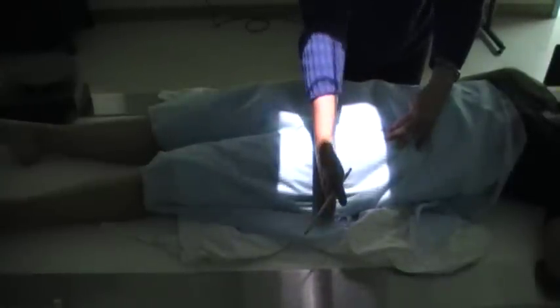For the hip x-ray, we're going to do the AP and the frog leg lateral. First on the AP hip, to help localize where the hip joint is, palpate on the patient the ASIS. The pubic symphysis is going to be at the same level as the greater trochanter prominence. So this is the level of the pubic symphysis, and we're going to draw our line there — I'm just placing out lines with my sticks.